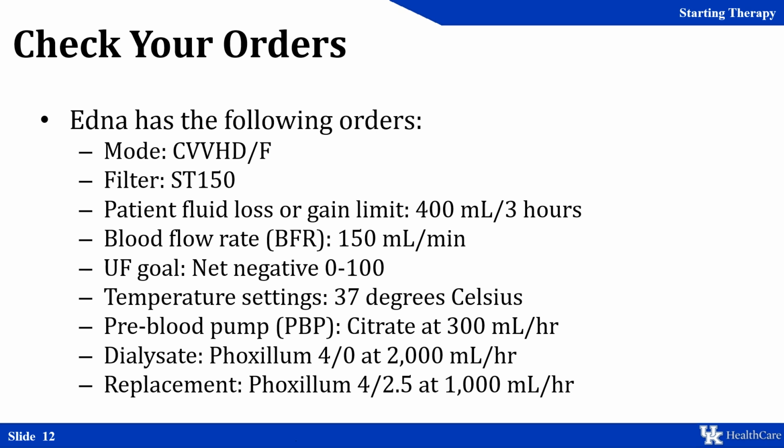For example, if one of the pumps delivering fluid to the CRRT machine, let's say the green dialysate pump, were to become clamped, that patient would actually become net negative unintentionally because the effluent pump was always going to take off the white PBP plus the green dialysate plus the purple replacement. It doesn't realize that it's not delivering the green dialysate. So if the machine were to hit that limit where one of those bags is 400 grams heavy or light, it would shut it down for safety.